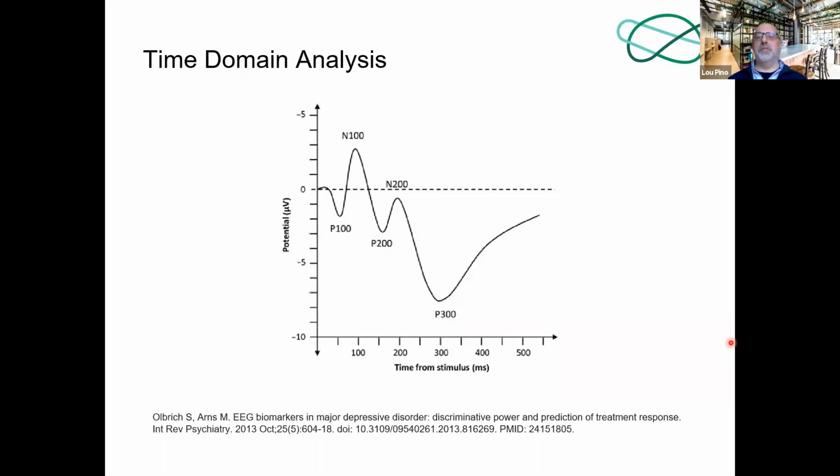So a person's wearing an EEG headset and they're listening to tones that sound something like this. Beep, beep, beep, beep, bop, beep. The P300 will show up for the oddball tone, which is the bop in the example I just gave, which is the surprising tone because it happens rarely. An interesting thing is that the P300 can be used as a measure of brain health.